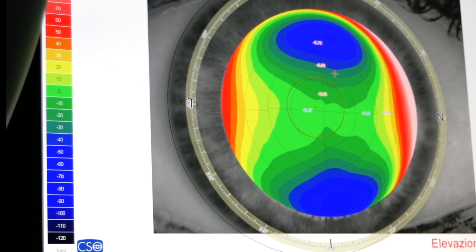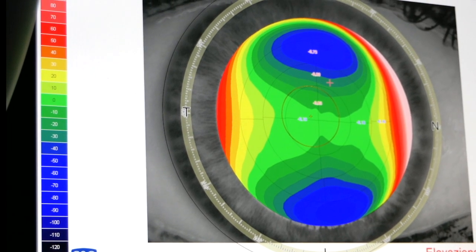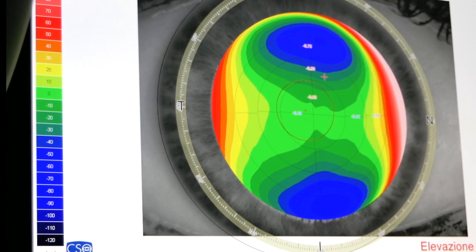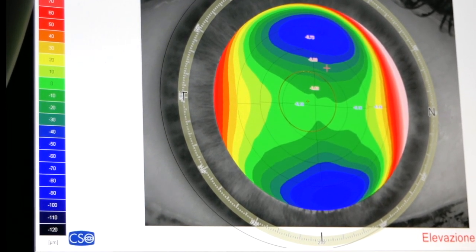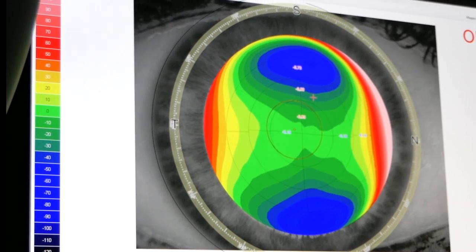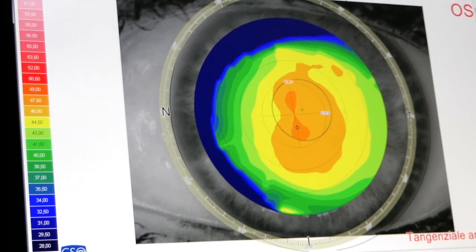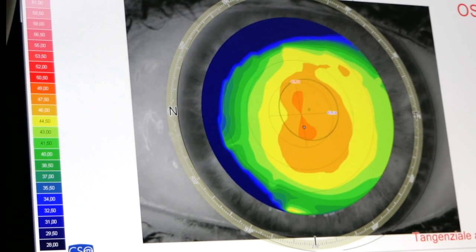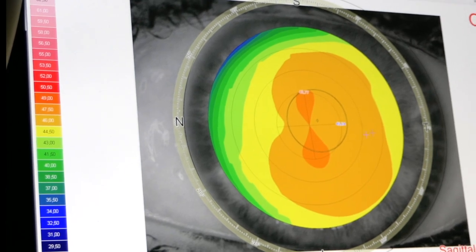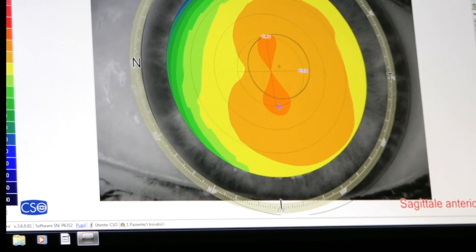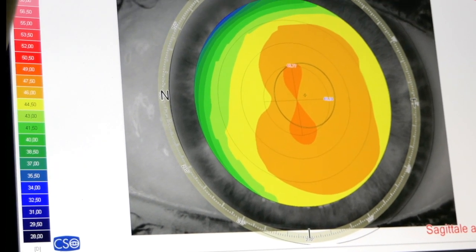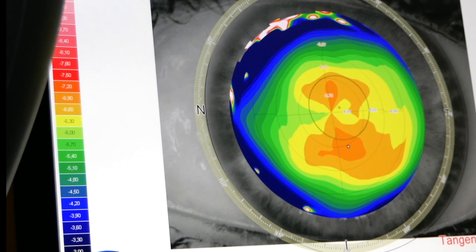This is an altimetric representation possible only with an altimetric topographer that combines the disc with the capture of images with a Scheimpflug camera.